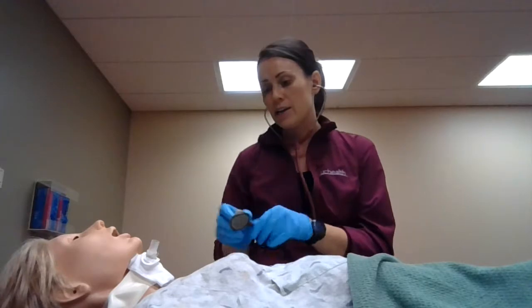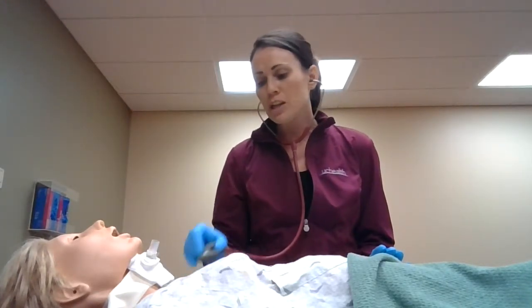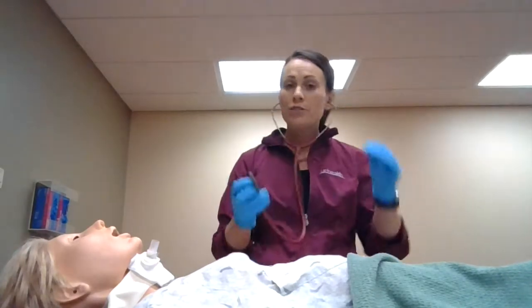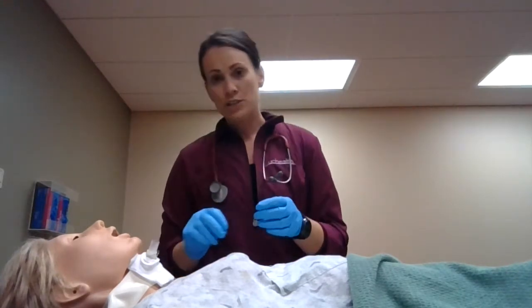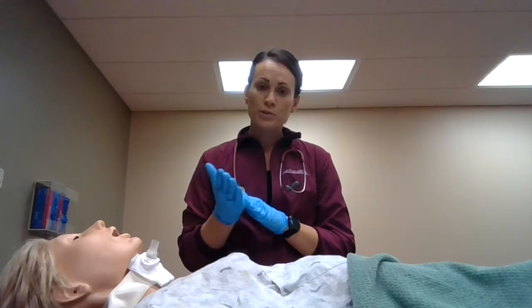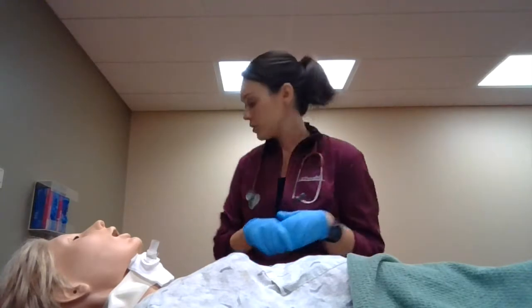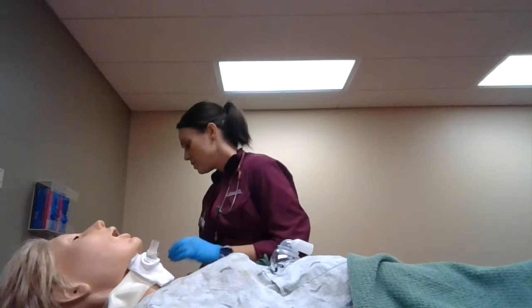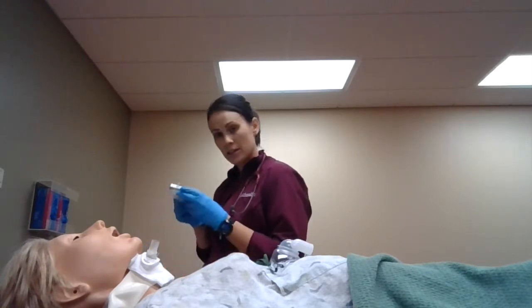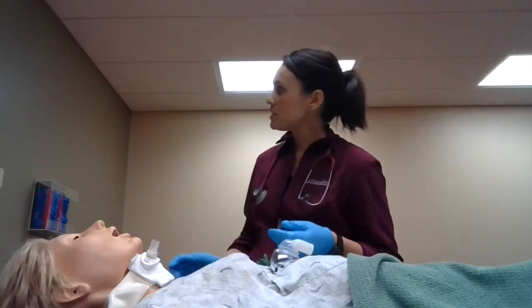I'm going to check the patient's respirations and her SpO2 saturations. I'm going to check that cuff pressure to make sure it's in between 20 and 30 centimeters of H2O. Then I'll go ahead and get started. The first part of trach care is sterile suctioning, so I'll make sure that suction is set up before I start that sterile procedure. I'll set suction from negative 120 to negative 150, within that range.